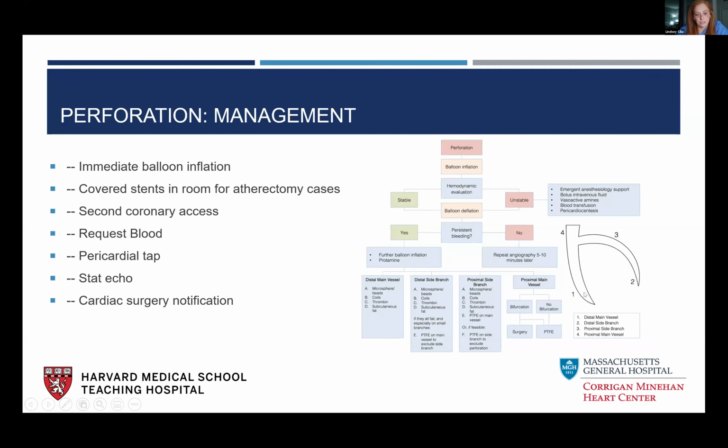But if there's any questions, feel free to chime in and chat about any of these charts that I showed. And then, Michael, maybe for a reference, since a different institution, but similar practices, is it pretty similar to you? Like in your cases, do you typically have the covered stent ready when you do atherectomy, or do you take a more conservative approach, trying to see how things go? How do you typically handle complex procedures?